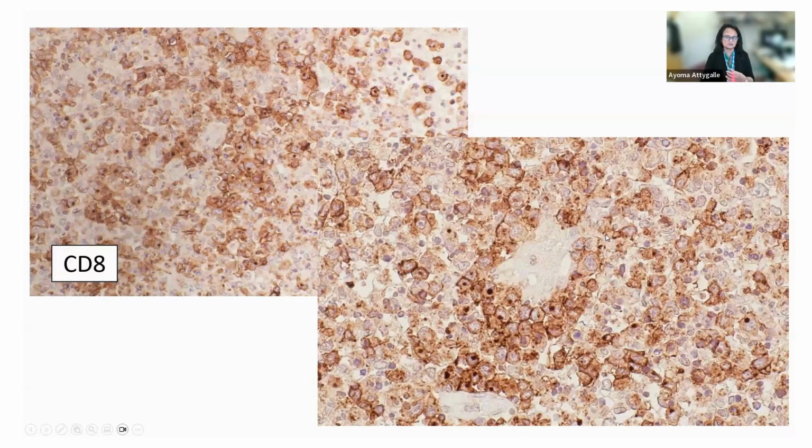So when this case came to me, the pathologist who sent it to me was querying lymphoma in this 21-year-old. And my registrar at the time looked at it and said, gosh, this has to be lymphoma. So I think you have to really be careful about overdiagnosing. Take the age into consideration. Look to see what type of lymphoma it could be. My former boss used to say, if you can't work out what type of lymphoma it is, you know, it might not be lymphoma. So I think be really careful and take the whole picture. Just don't look at one immunostain and go down that route.